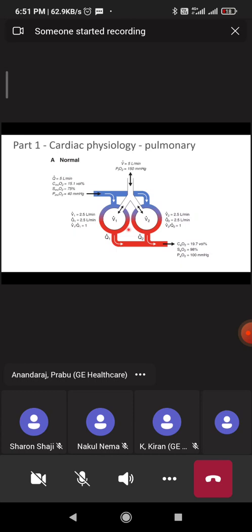Whether you are using a pediatric circuit or adult circuit, that compensation is there in the ventilator. But beyond the Y piece, because there is a bias flow, the bias flow will continue to keep clearing all the exhaled carbon dioxide and keeping it away from the dead space. It will not allow artificial creation of dead space.